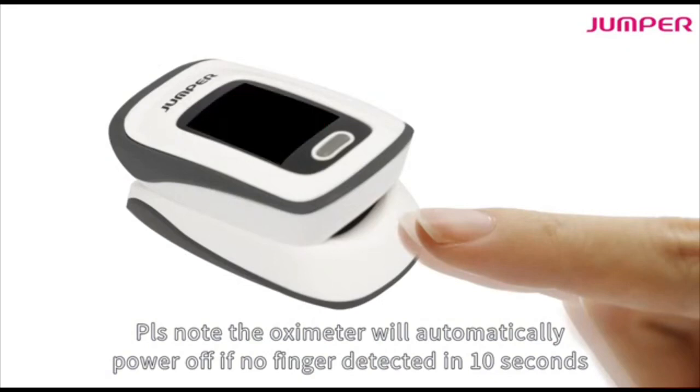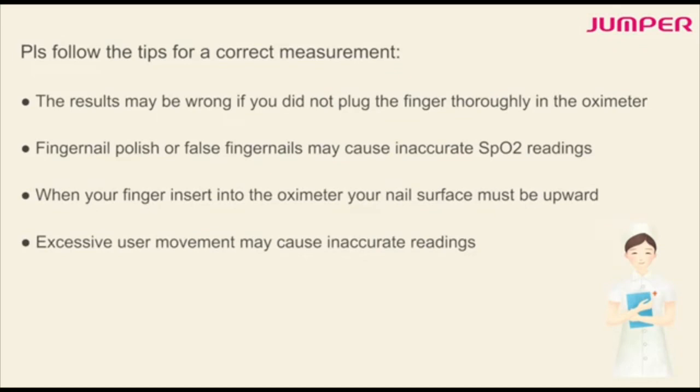Please follow these tips for a correct measurement. The results may be wrong if you don't plug your finger thoroughly into the oximeter. Fingernail polish or false fingernails might cause an inaccurate SpO2 reading.